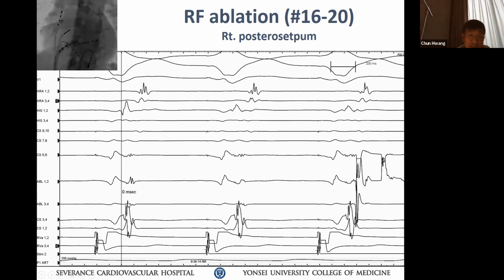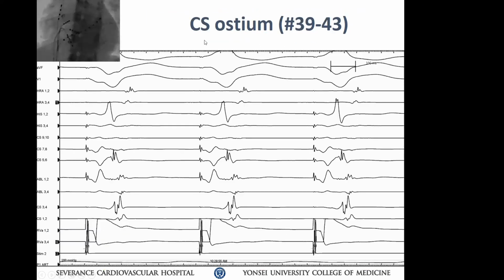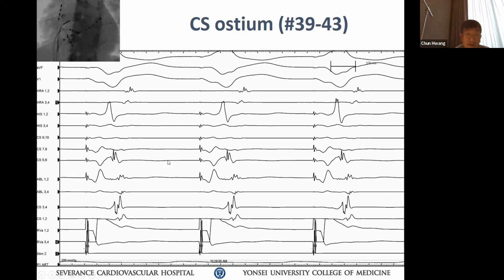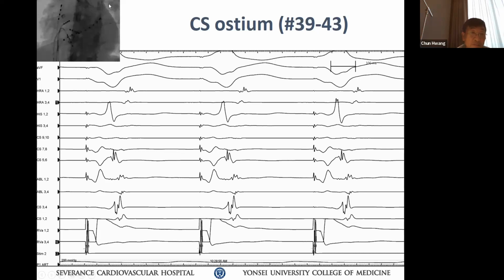Your CS 5, 6 is earlier than ablation. 그 라인이 지금 들어간 게 틀려서 조금 더 왼쪽 왔어야지. 예. 오케이. 근데 재밌는 거는 CS 시그널도 다 farfield이야 지금 보면은. 오케이. 계속 가. 근데 이거 왜 어블레이션 시그널 이렇게 많이 잡았어? 보여주느라고? 저 위치까지 다 Yes. 오케이. 어블레이션. 근데 지금 CS EGM이 바뀌었네 또. 캐터가 움직인 거야? 어블레이션 하면서 좀 라이트 사이드에서 저기까지 시도를 했어. 오케이. 근데 보면은 레이트 됐지? 액티베이션 시퀀스가 아까보다. 오케이. Keep going.